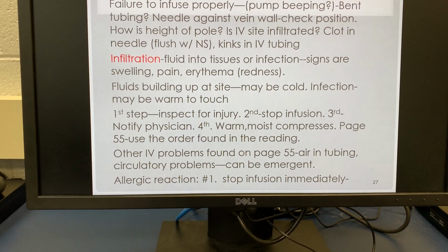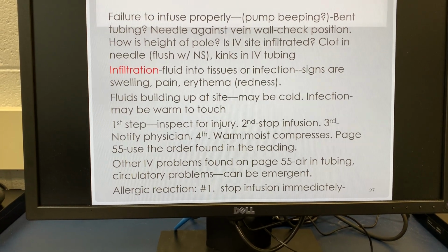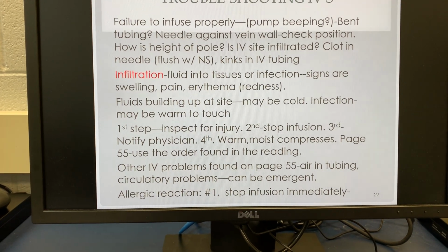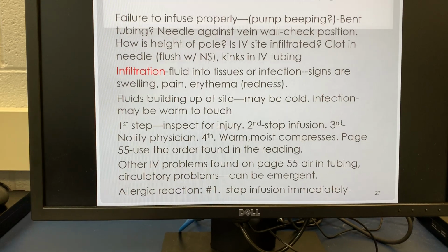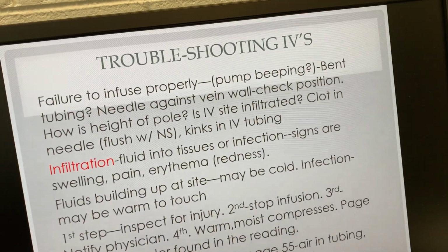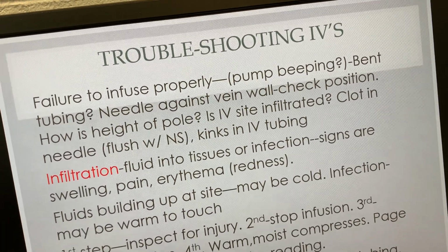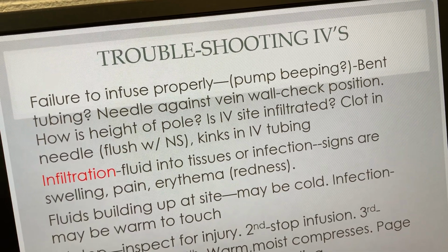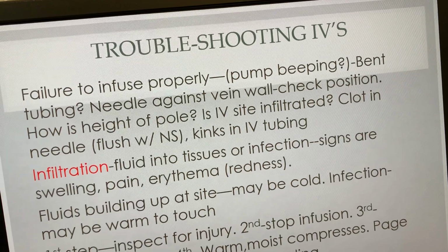Now, when you have a suspected infiltration, these are the steps, and you need to present them in the order they are in the PowerPoint. When you see infiltration, you'll see the steps to taking care of the problem.